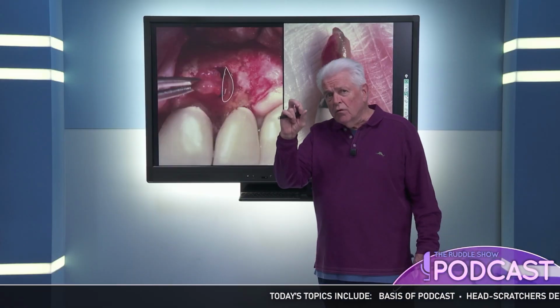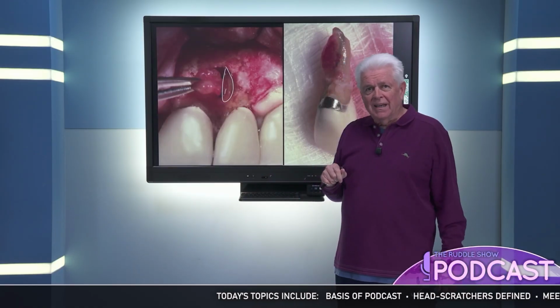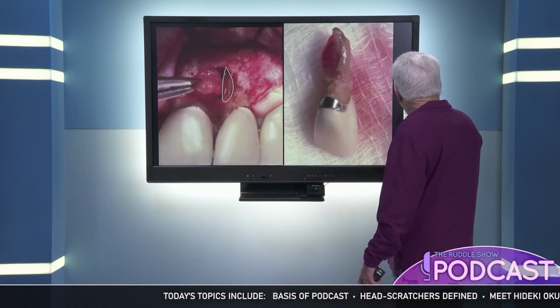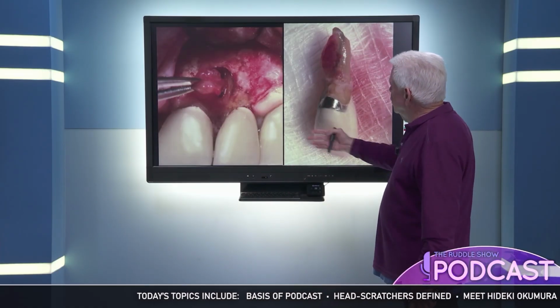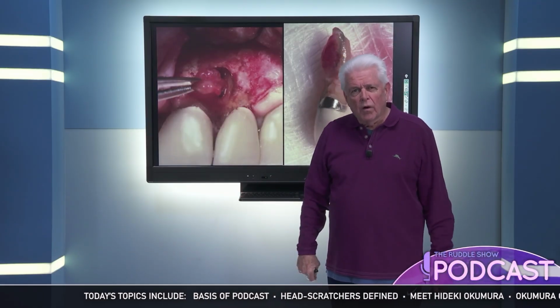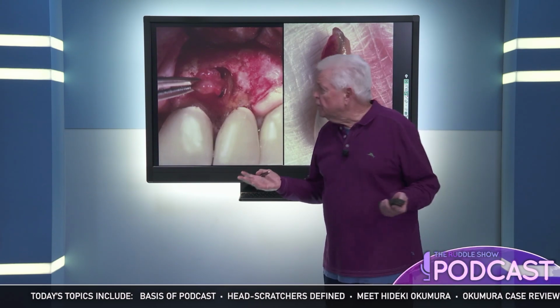That's a little tiny retrograde mirror to stick around the back of the root. And I could get it in there, but I wasn't going to be able to do it. I didn't have the skill. So what we did is had to stop everything, suture. And he wondered why we were suturing. We hadn't made the repair. And I said, there's only one thing left to do.